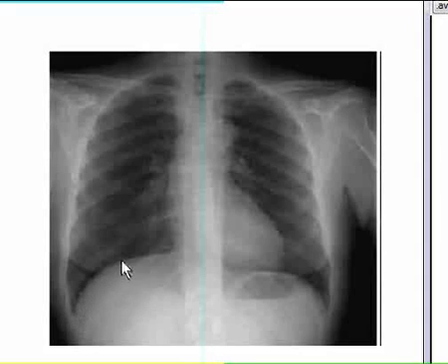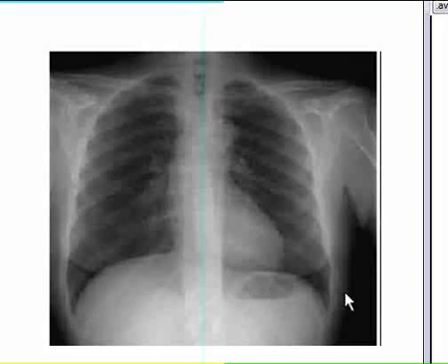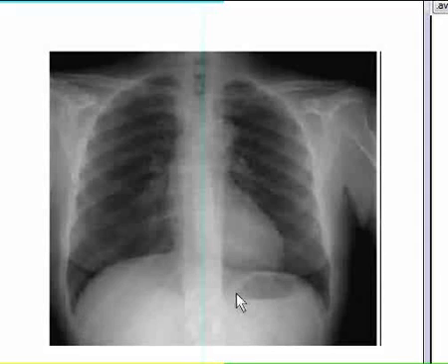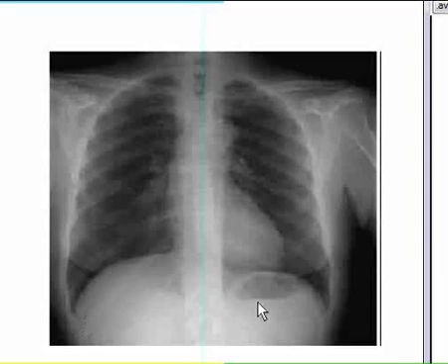Right hemidiaphragm. Left hemidiaphragm. This bubble is in the stomach. And usually the right diaphragm is higher as compared to the left one — this is normal.